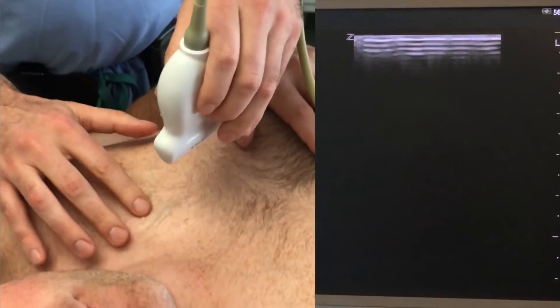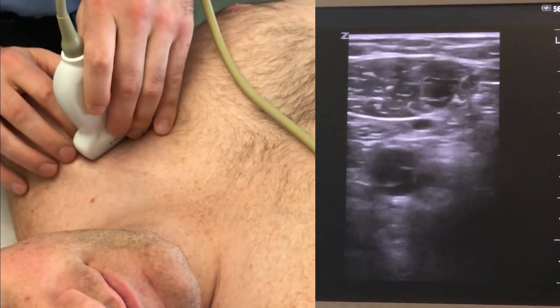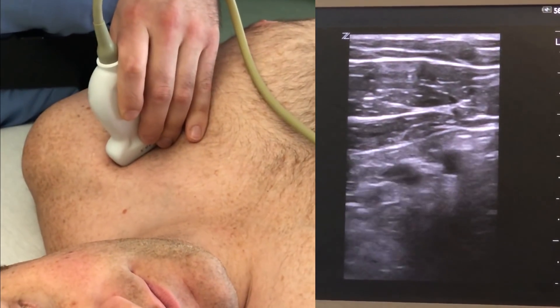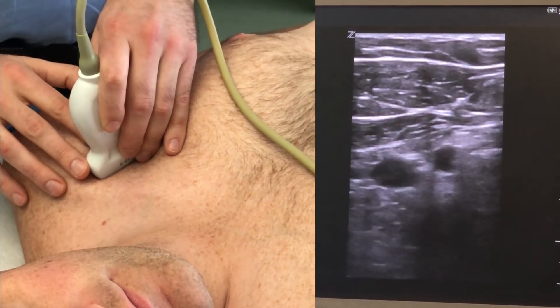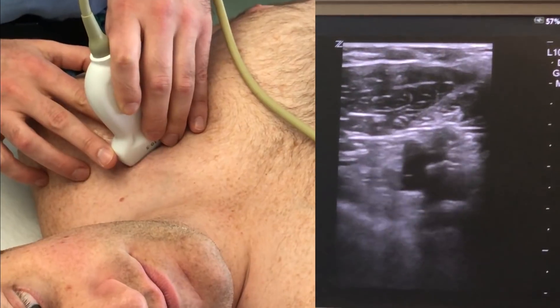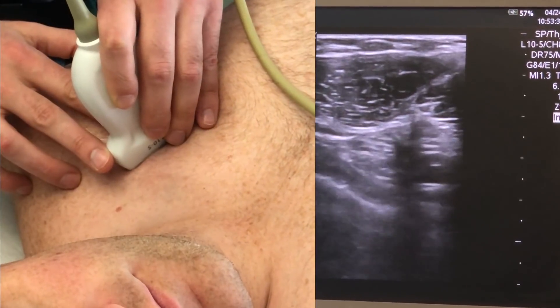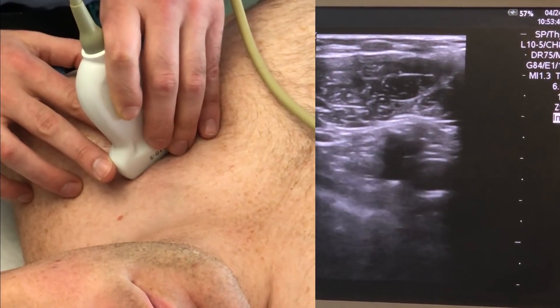We've got the linear probe in a transverse orientation here. A neutral position is perfect. Starting out laterally makes it easier to identify the vessels. There we can see the axillary vein on the left and the axillary artery on the right. With a little gentle compression, you can press it and see the axillary vein collapse. Now as we trace these in a little bit, you can see the vein getting a bit bigger. This is a shot where you can see the lung slide posterior to the vein, pretty close to the vein — also the vein is kind of small and collapsible. This is an example of the place you would really not want to go.